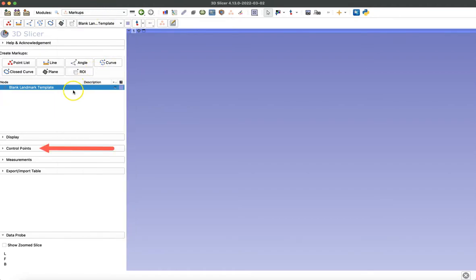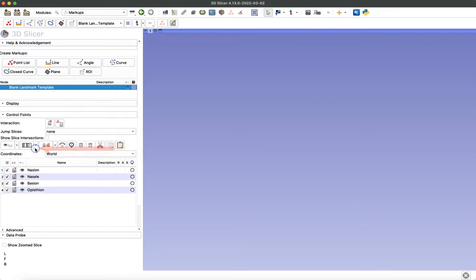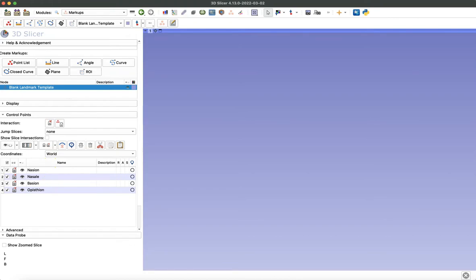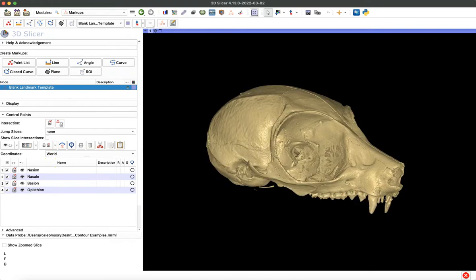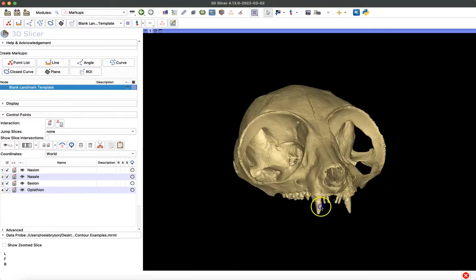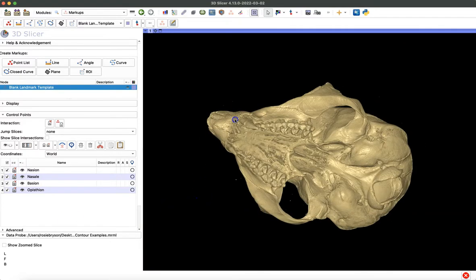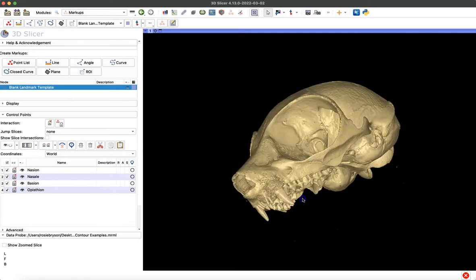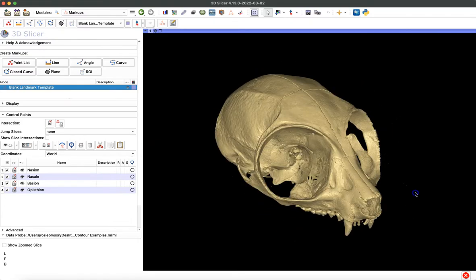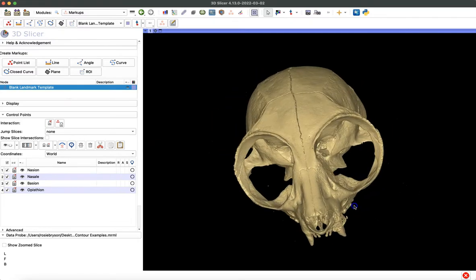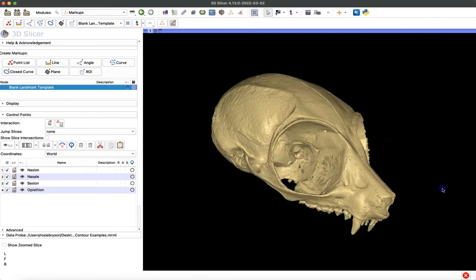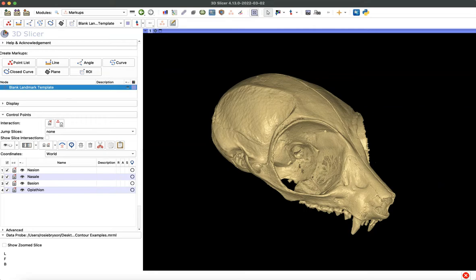We're going to expand that control points menu again, and we can see all of our empty landmarks ready to go. We can assign coordinates to them now. I'm going to load a model of a skull so that we can practice placing landmarks from a template. The first thing you want to do when you're ready to start collecting data is to orient the model so that you're visualizing the area where you're going to place your first landmark. For us, in this case, it's nasion. I'm going to rotate this model to see the front of the skull.